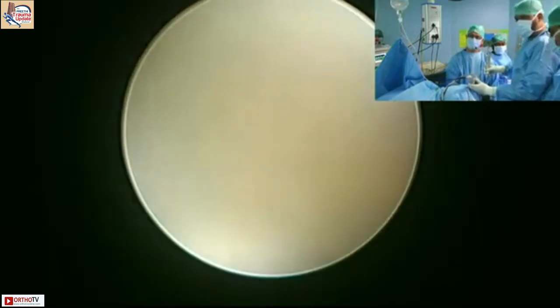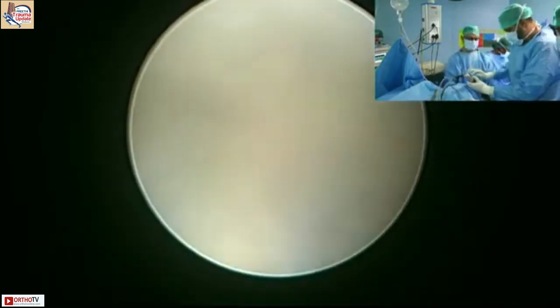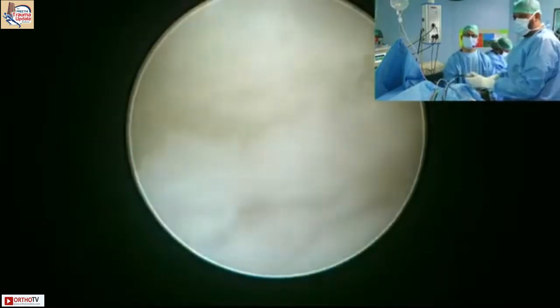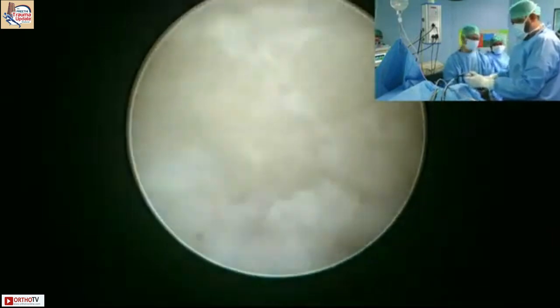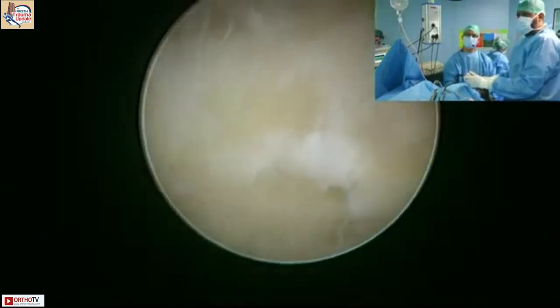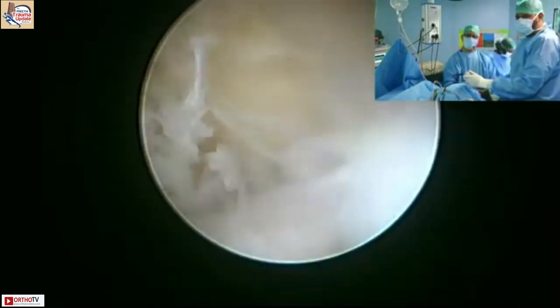Can you just tell the audience what all you can do in the posterior elbow? One is the osteophyte, loose body removal, then? So when you ask what beginners should do, we've been doing elbow arthroscopy for a reasonable amount of time, and you can still see a struggle. That gives you an idea of how difficult the joint is.